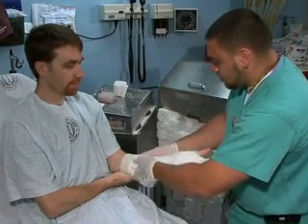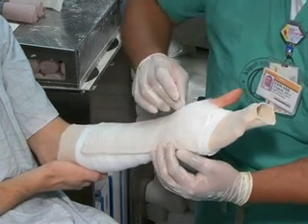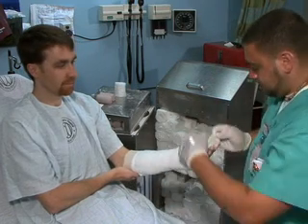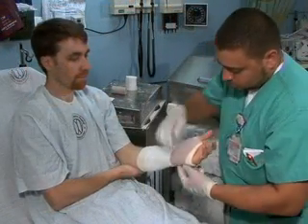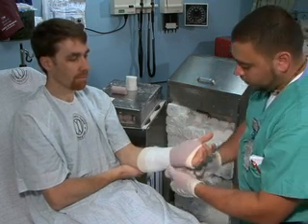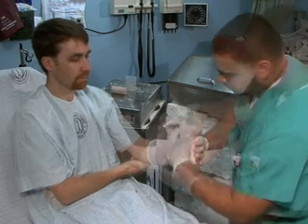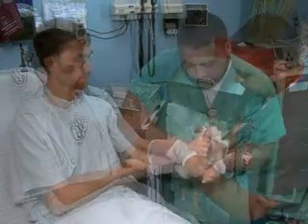Place the plaster material over the cotton padding. Smooth the plaster to mold to the contours of the extremity in the appropriate anatomical position. Apply an additional layer of cotton padding to hold the splint in place and fold the ends of the stockinette back over the splint. Use an elastic bandage to secure the splint in place by wrapping it in a distal to proximal direction. Avoid excessive compression of the extremity when applying this elastic bandage. Before the plaster dries, place the extremity in the desired anatomic position.